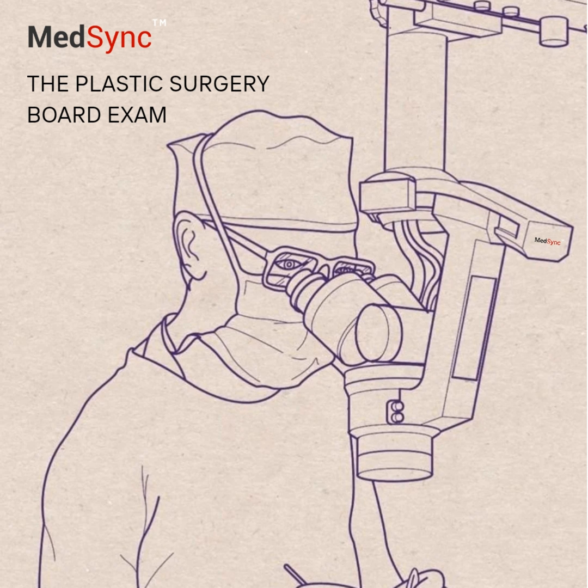What about established enterocutaneous fistulas? That's an evolving area. It's sometimes used as part of the management strategy, trying to control output and protect surrounding skin. Low output fistulas might even close faster with it.